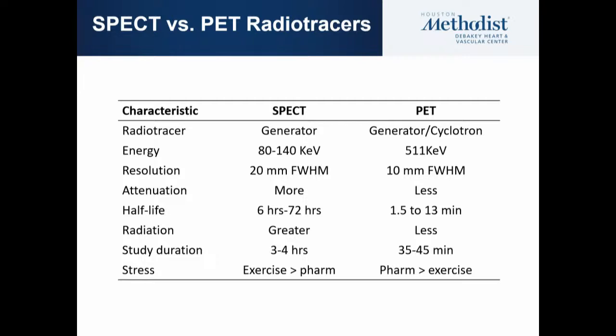The half-lives are very different, but in general, the SPECT radiotracers' half-lives are usually much longer compared to PET. So even though we're sometimes injecting more radioactivity and higher keV with PET, since the half-life is very short, the patient exposure is much less with PET.